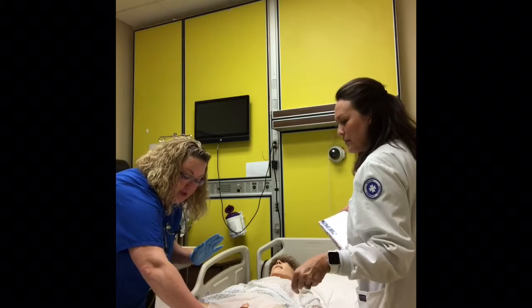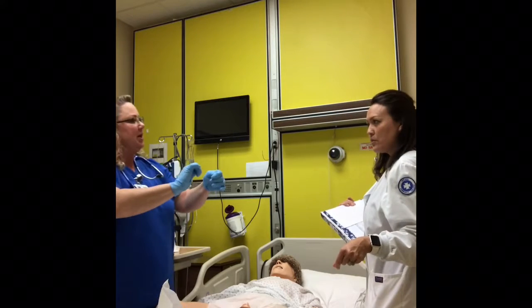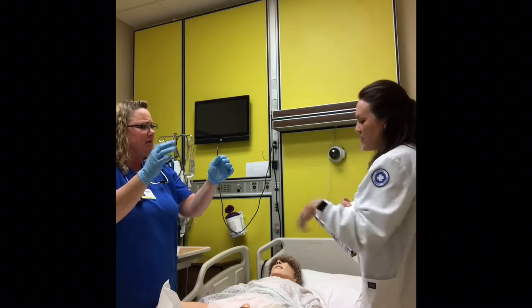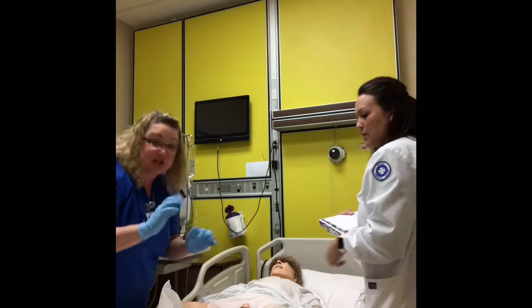What I'm going to do at this point is, what's the technique when they tore the end of the blue off and put it in the lube first? But then you have to take the whole sleeve off anyway. Take the whole sleeve off? Okay, great. So she's teaching me.